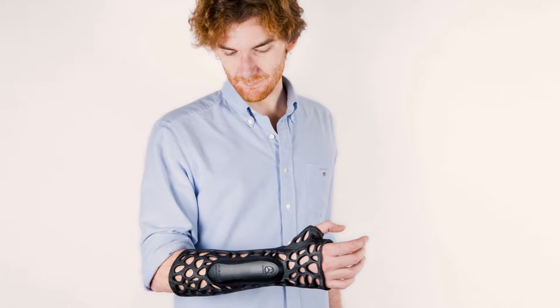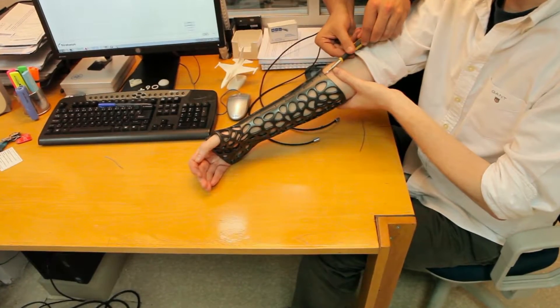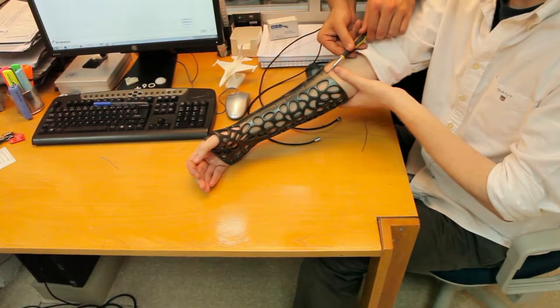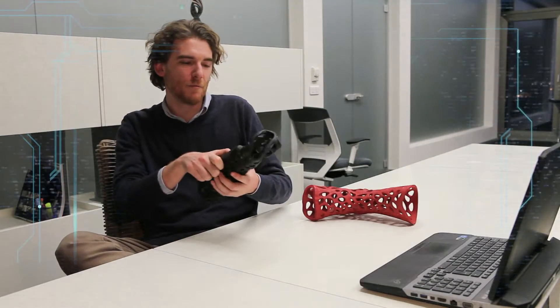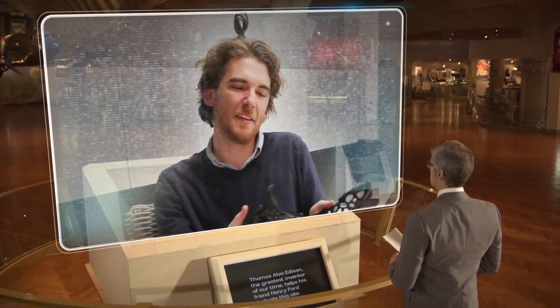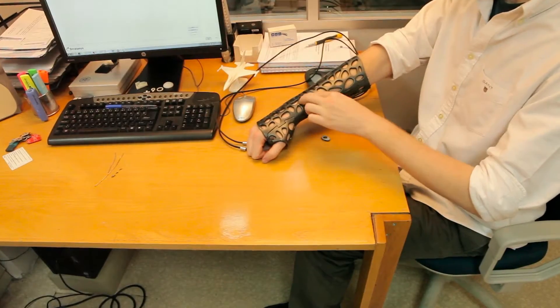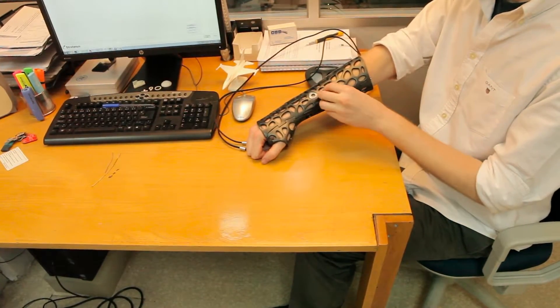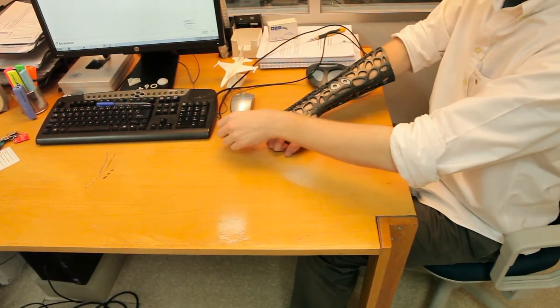Although Osteoid is still in the clinical trial phase, Deniz hopes someday it could help people suffering with chronic diseases like cerebral palsy. We have this idea to embed a microprocessor and some sensors inside the splint so that it can detect spasms in the body, and over time we can see how well the patient is reacting to physical therapy.